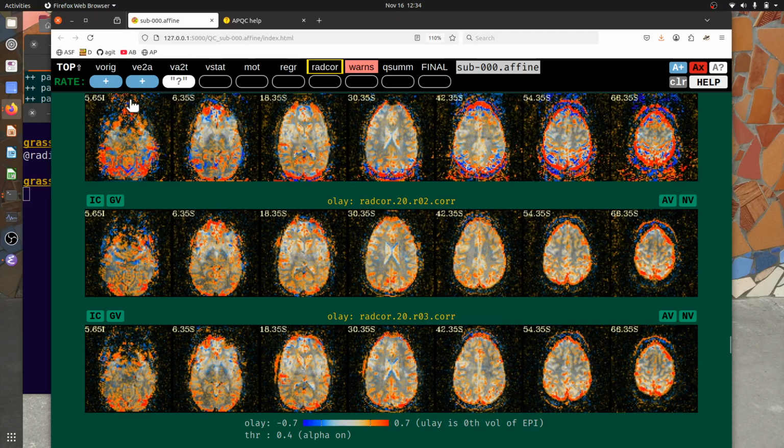We said it's similar in that there's the highest values around the edges, and actually we see here some ghostly edges outside the brain. Those are really where the skull is as well. Down here in the most inferior slices, we'll see some more things. This is typically maybe around the eyes, we might see more, or with ghosting. And often these higher values around the edges, both of the brain and of the skull outlining it, are because there's a little bit of motion in almost all EPI scans, as well as some other effects.